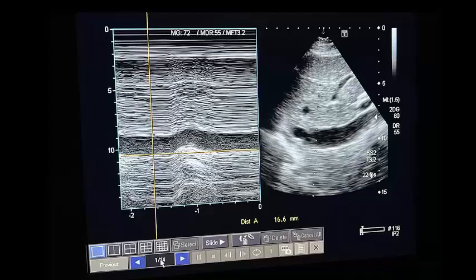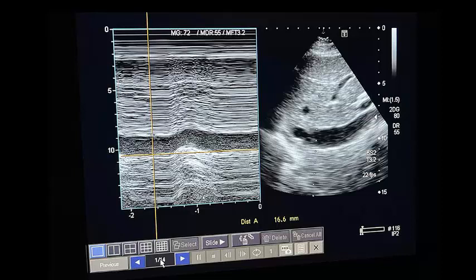We sent all investigations and started the first critical care ultrasound, beginning with the IVC. It is on the dilated side — not too much dilated, but not collapsing. You can appreciate that CVP is almost 10 in this patient.